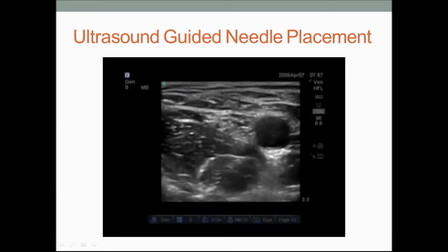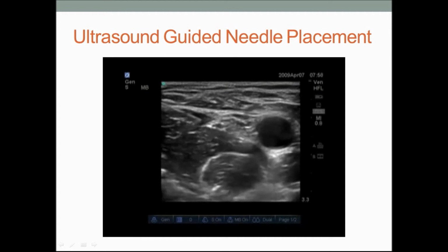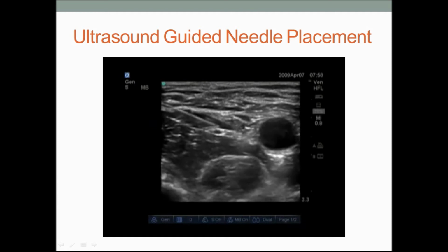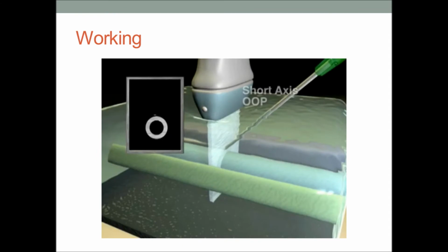Now if you observe carefully, in the left hand side of the image there's a bright line. This line indicates the position of the needle, and as you can see, it's gradually going along the needle path. I hope by this time you have understood how the ultrasound device is used by anesthesiologists. Now I'll try to explain some of the challenges involved in using this.